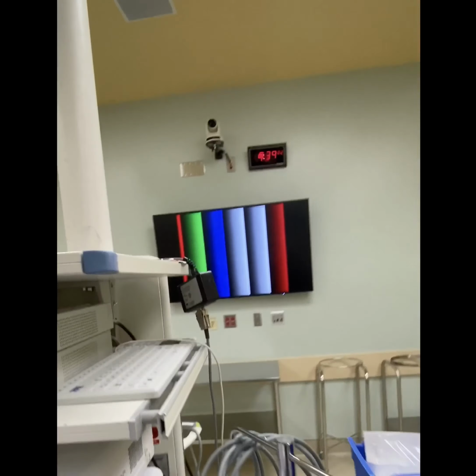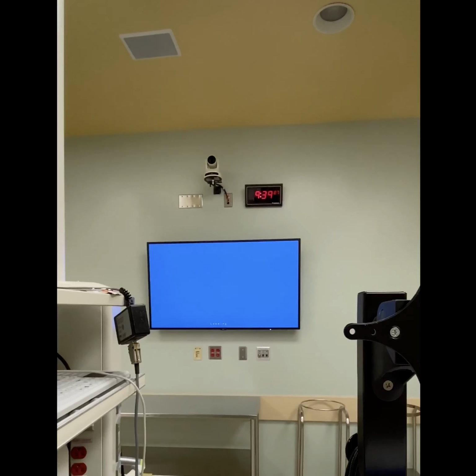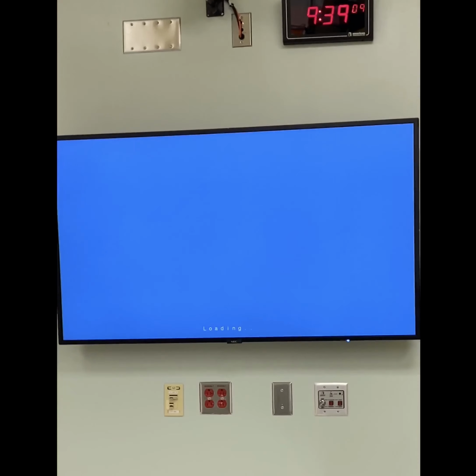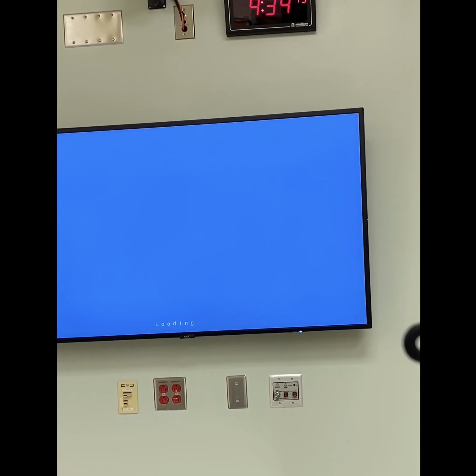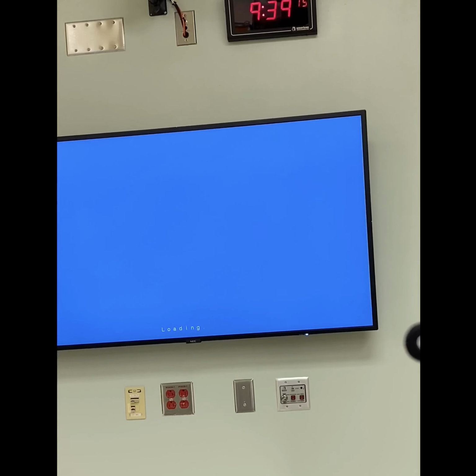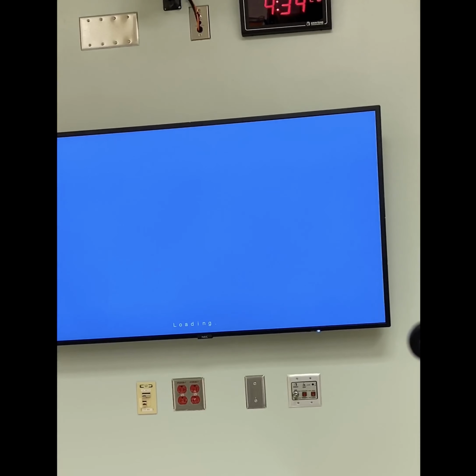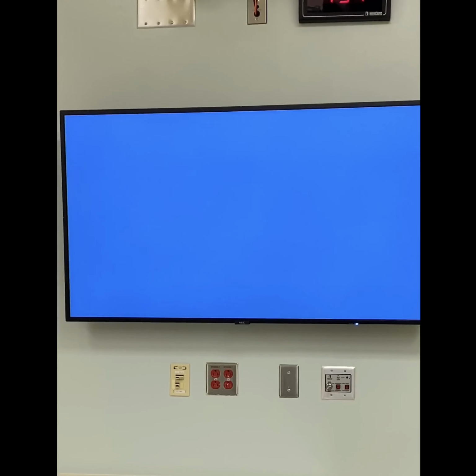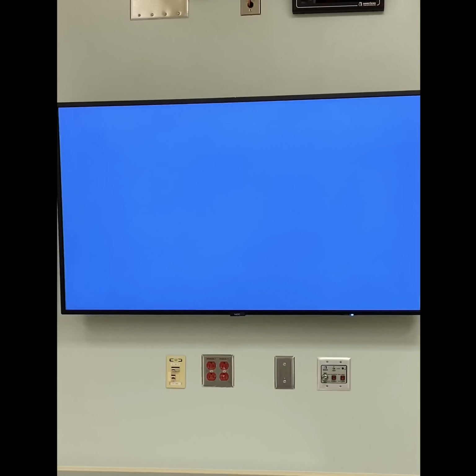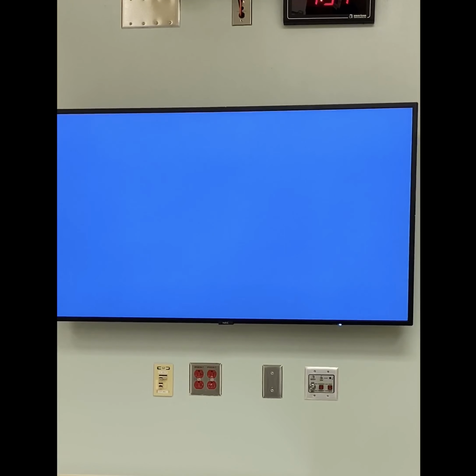Once you turn it on, you're going to notice that the screen is loading. It should say eventually "multi-camera function" on the screen. It's going to flash and then it might go away, but that's how you know you're on the right track here. Let's see if it says it this time. It's still loading. It takes a little bit.